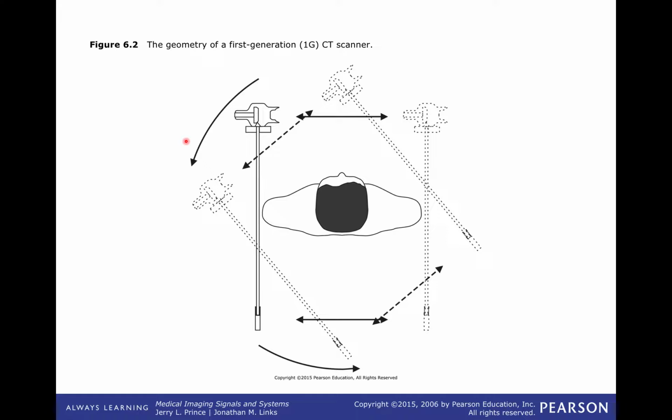So the initial computerized tomography proposal or system was built by Godfrey Hounsfield, and he worked for EMI, and we talked about that in the introduction. And EMI had a lot of money because the Beatles had just made a lot of money. And so they had this big research program, and they let him, he worked on business computers, and then wanted to do a sabbatical on something crazy, so he did this imaging project.